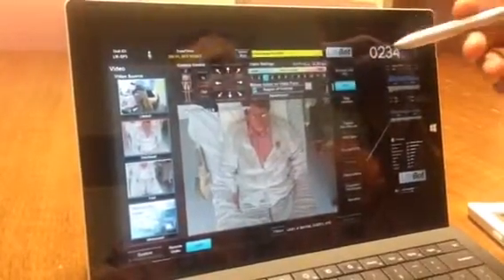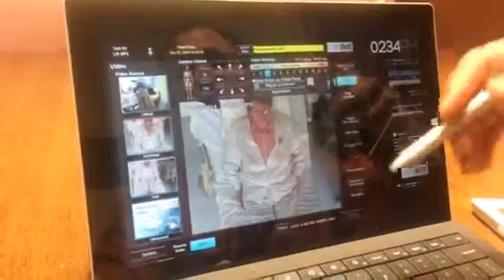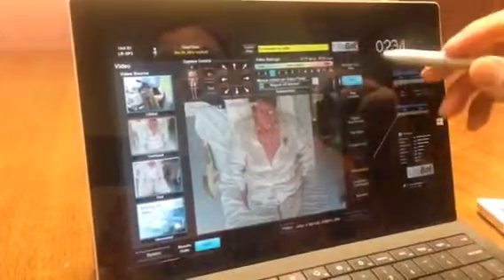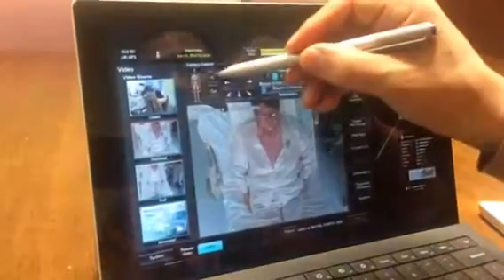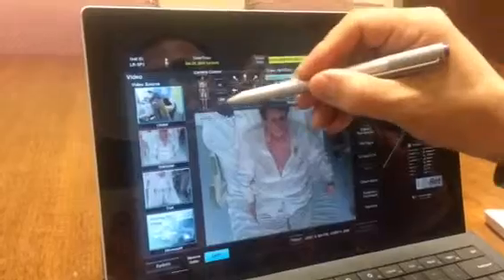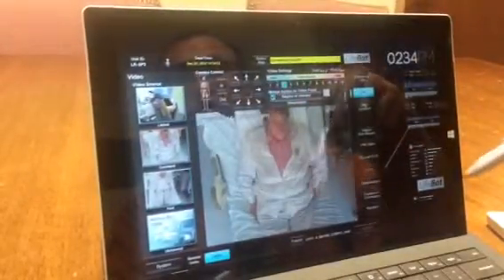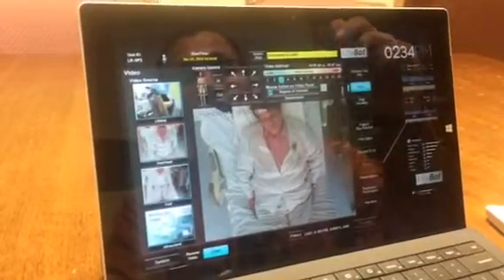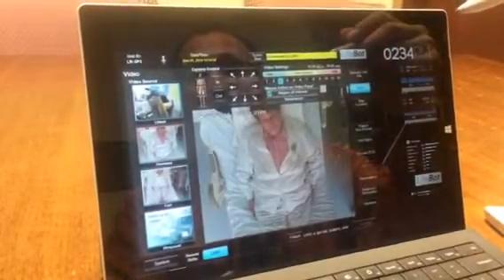You can examine the patient, ask them to perform a gross neurologic examination. You can focus in on the patient by zooming in with the in button or out to get closer looks at the patient. And again, make sure that you document everything on the T-sheet.